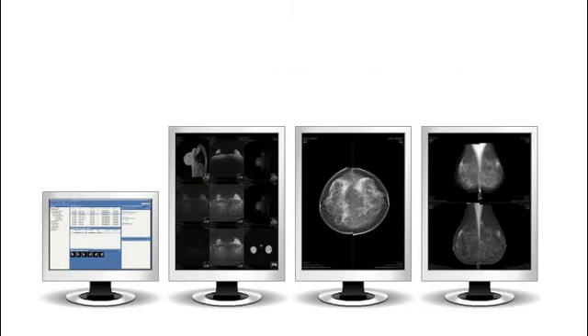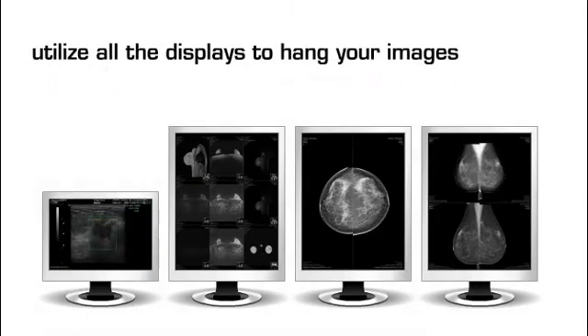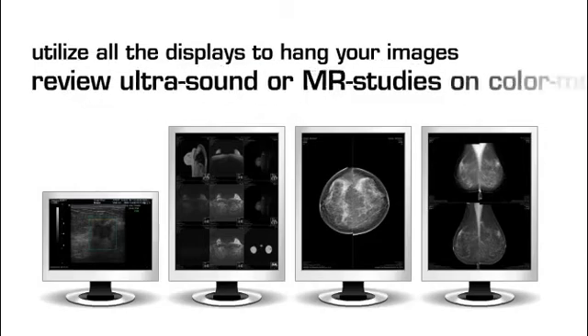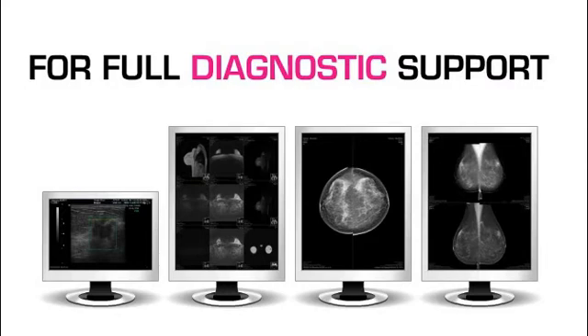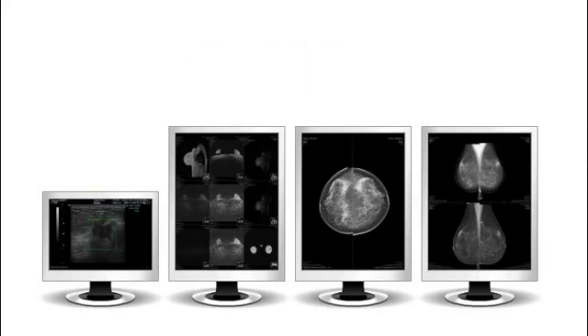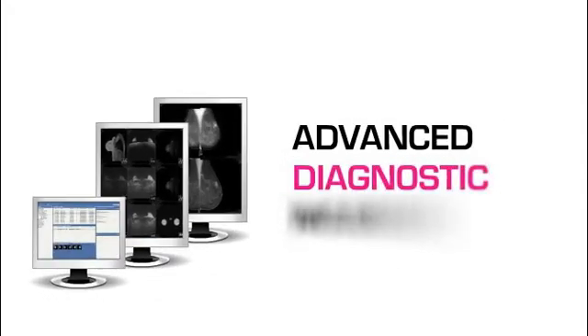A key benefit is that you can utilize all the displays to hang your images. This way, you can review ultrasound or MR studies on color monitors for full diagnostic support, which is particularly useful for MR-CAD. These features, among others, also optimize Sektra Breast Imaging Packs for advanced diagnostic mammography.